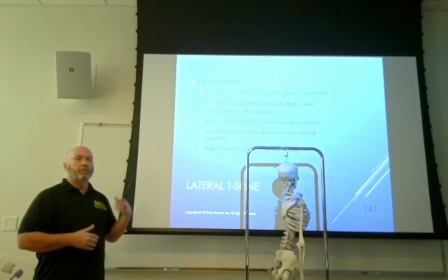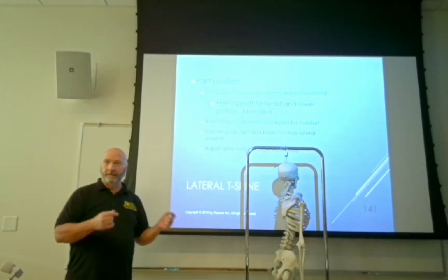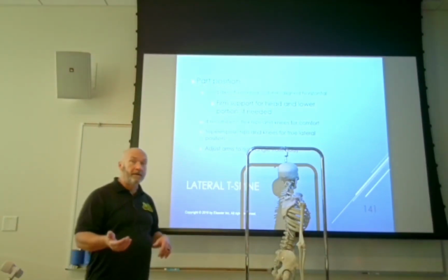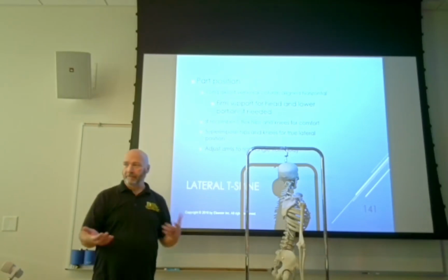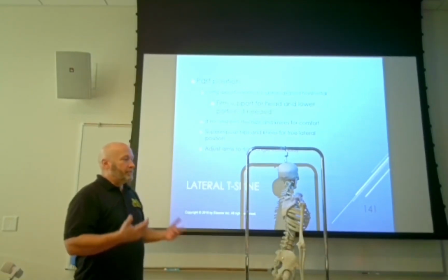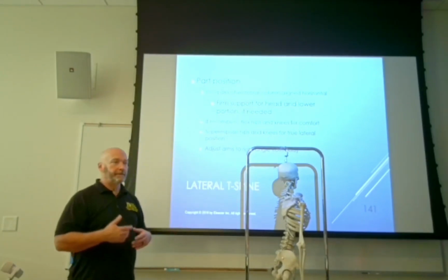Okay. You're probably not going to be seeing this happen a whole lot in clinicals. People just don't want to take the time to put stuff under the patient. Plus, our computer algorithms do such a good job of showing everything that it's going to cast an artifact in a lot of cases. So what you might see then, rather, is angulation of the central ray.